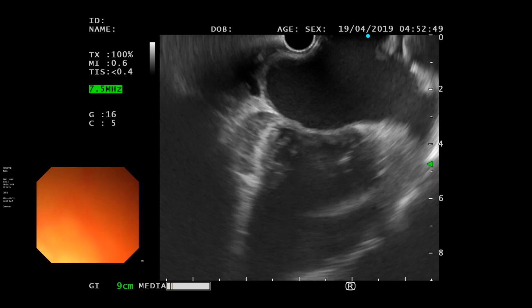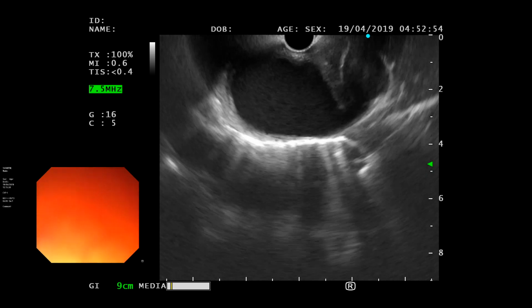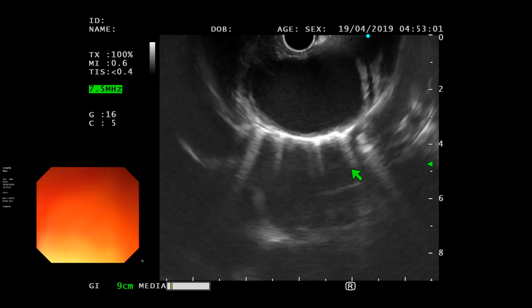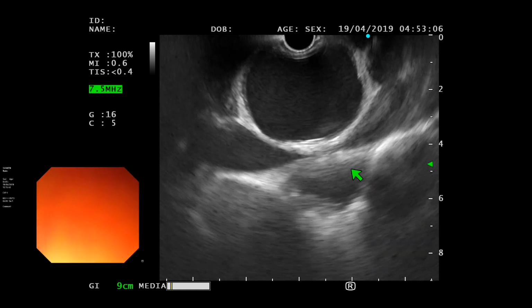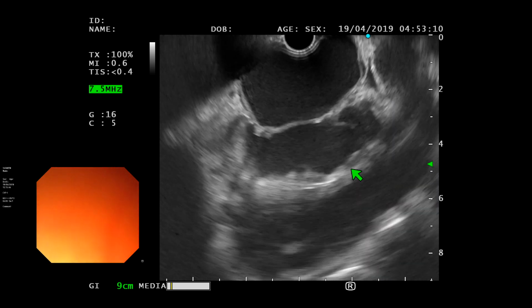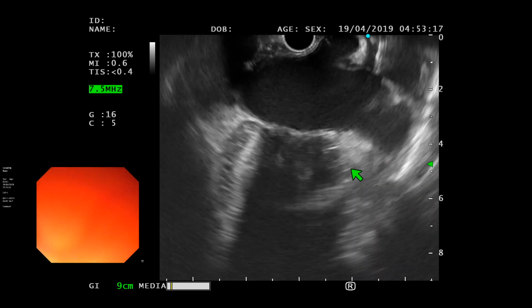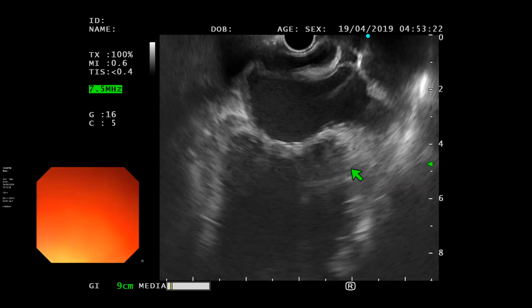So the bigger ball, as you see, इसको वापस लेके आओ. So that's it. So the bigger ball that you see, where's the cursor here, guys? Yeah. So that's your left atrium, right? Now, if you slightly anti-clockwise, so counter-clockwise is this. So if you relax your shoulder ever so slightly, you will see that the left ventricle starts to come under the, and this is the valve. And left ventricle, that's, you go slightly anti-clockwise for me more, please. And as you pull, no, you go slightly easy.